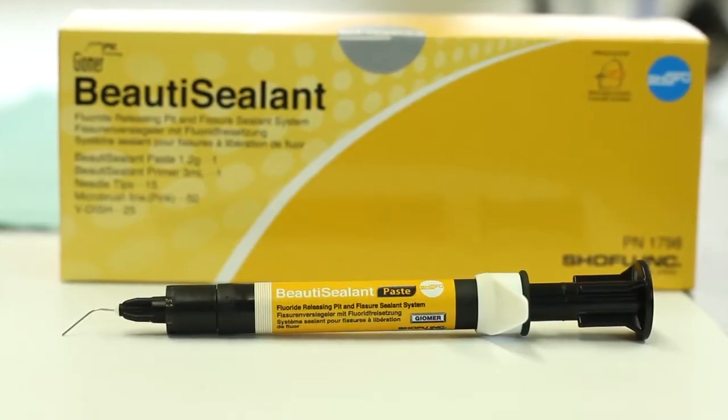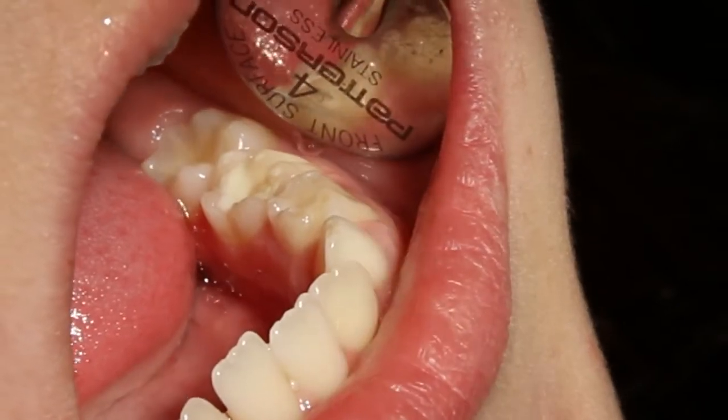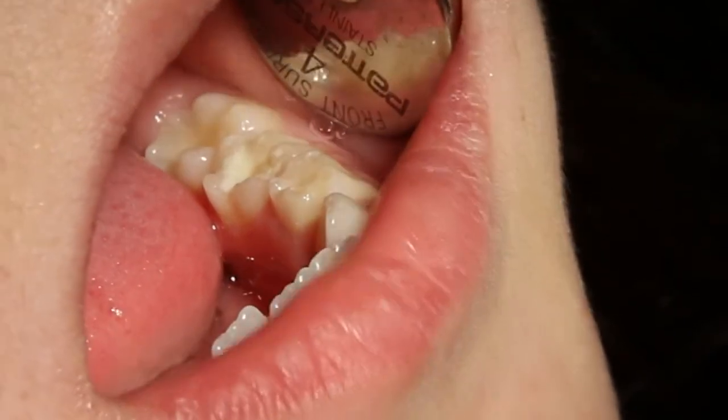It's important to be able to use sealants on our pediatric patients to keep them safe from decay, but it's also important to use sealants with our older patients who may suffer from caries from head and neck radiation, possible root exposure from periodontal disease. It's nice to have a product that is comfortable and safe and does not remove any tooth structure to be placed in the mouth.